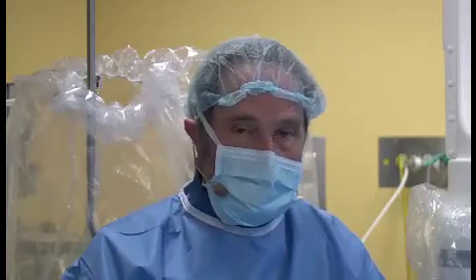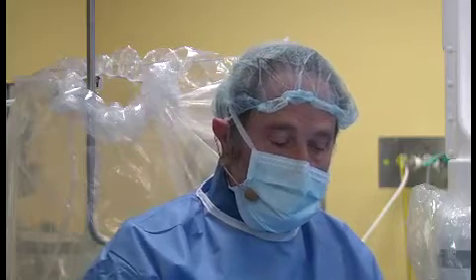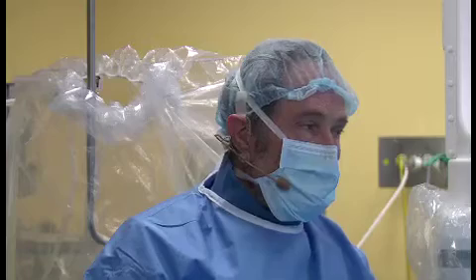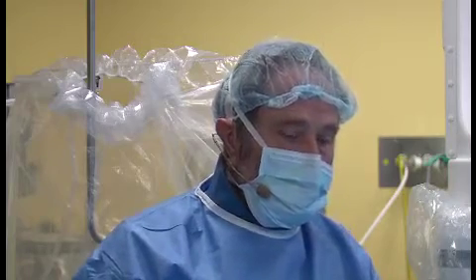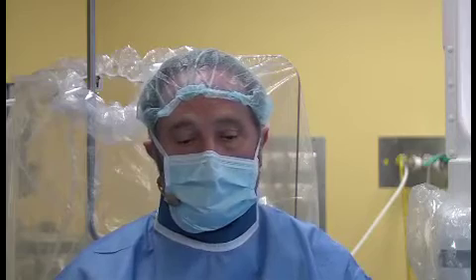Yeah. So, are there special views or things that you would like to see with regard to the question of erosions and things like that? How do you want to make sure that this device is not pushing too much on the wall of the left atrium, as a particular concern?